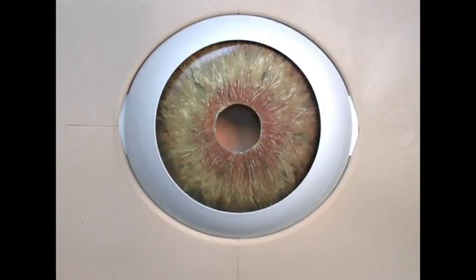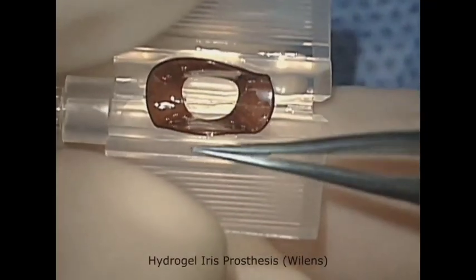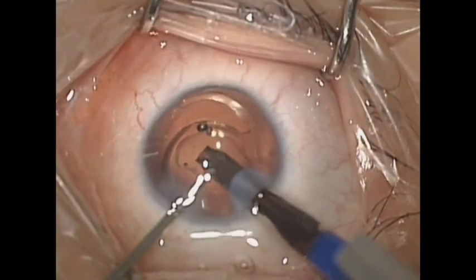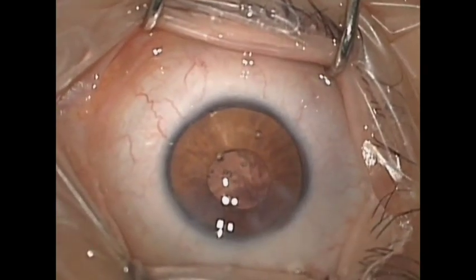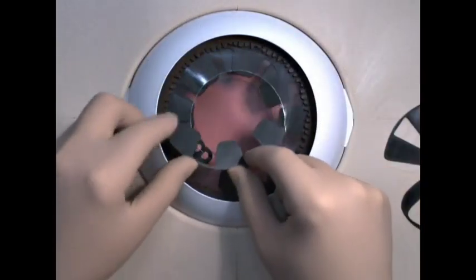They are composed of silicone, alternatively with a mesh for scleral fixation. There are also flexible prostheses composed of hydrogel. Here we can see intracapsular implantation. There are implants for intracapsular implantation available that can be combined to form a 360-degree diaphragm.